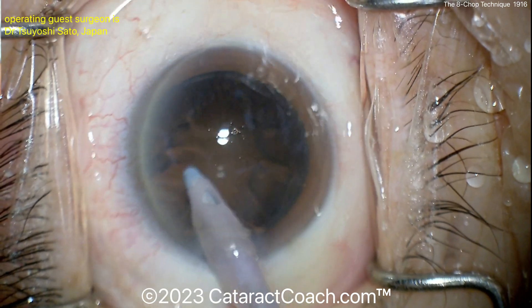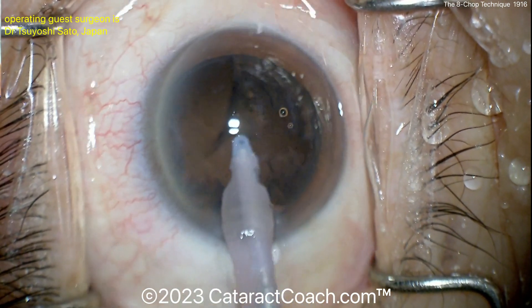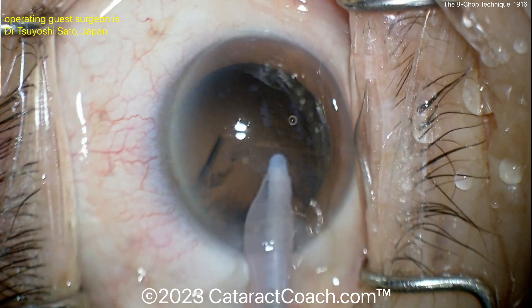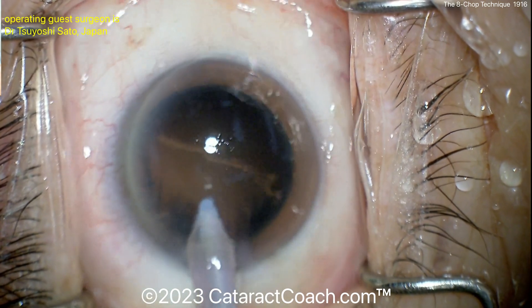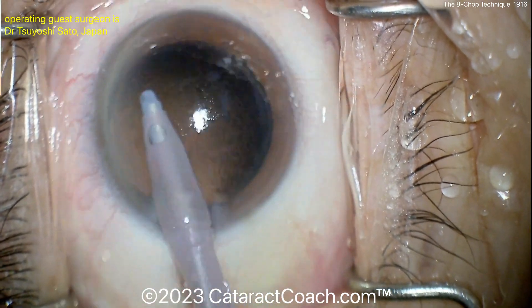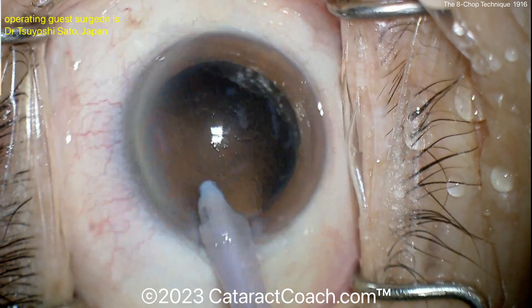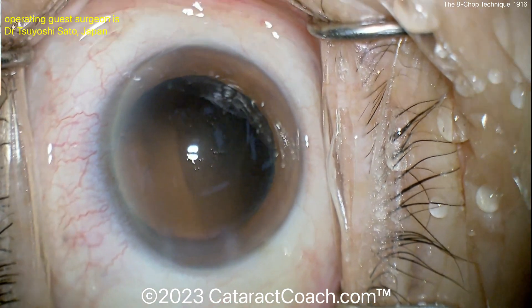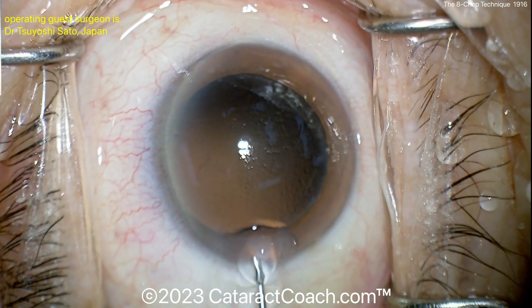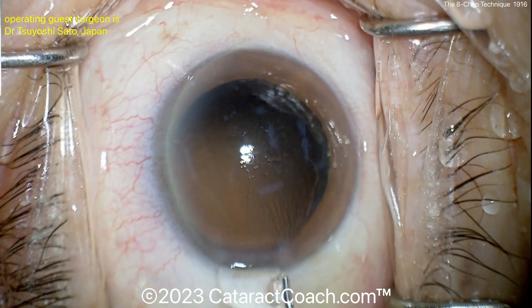Pre-chopper is a neat technique. For a denser nucleus it can be more challenging to embed the chopper into the center of the endonucleus. In that situation there's a second instrument done through the side incision — a side fork called a nucleus sustainer — to help hold the nucleus as you drive the pre-chopper into it. But for a case like this of modest nuclear density, you just put the pre-chopper in and break it up into pieces.